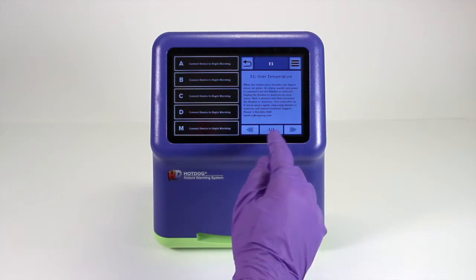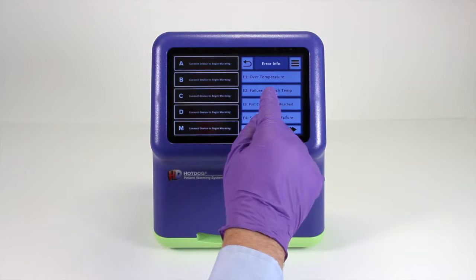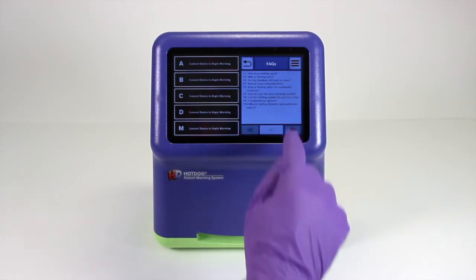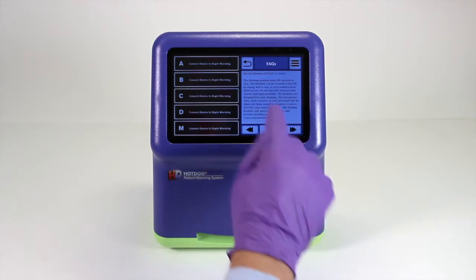For example, if an error message were to appear on the screen, detailed information on how to resolve it is also displayed at the same time. This information can be viewed under troubleshooting. The end user can also access answers to frequently asked questions.